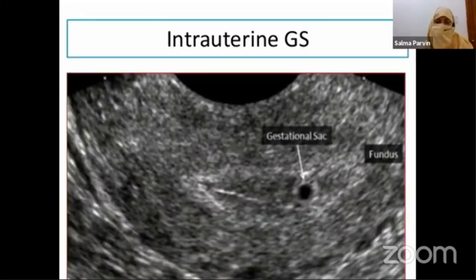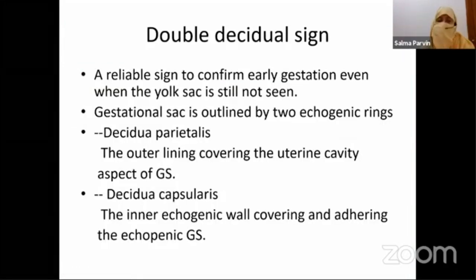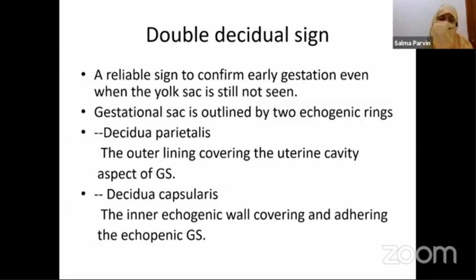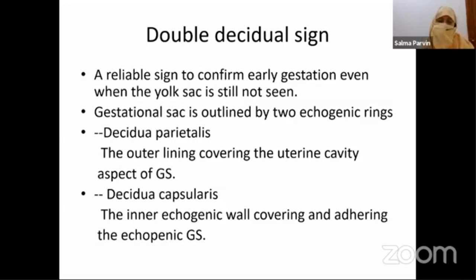This is a small gestational sac — just a drop of fluid inside the uterine cavity with trophoblastic tissue around it. The double decidual sign is very important. This is a reliable sign to confirm early gestation even when the yolk sac is still not seen, and even without a fetal pole. The gestational sac is outlined by an echogenic ring of decidua parietalis and decidua capsularis.